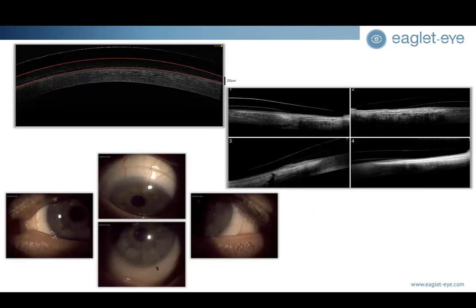You see this is an OCT scan on the top left showing corneal clearance with landing around the edges that matches the anterior segment photography on the bottom left, and the lens really was pretty awesome on the first round.